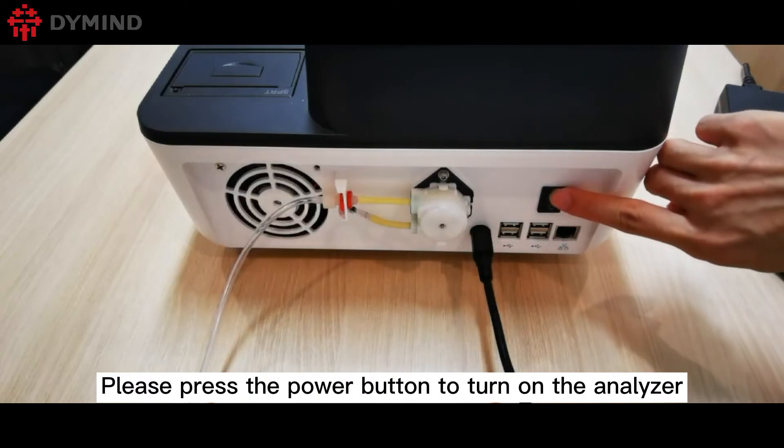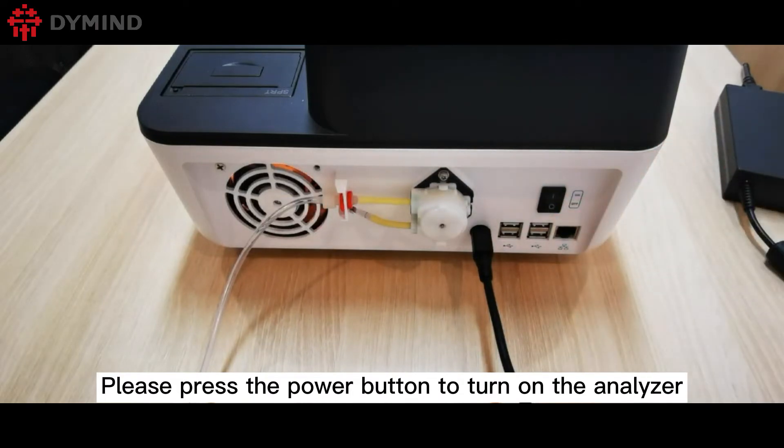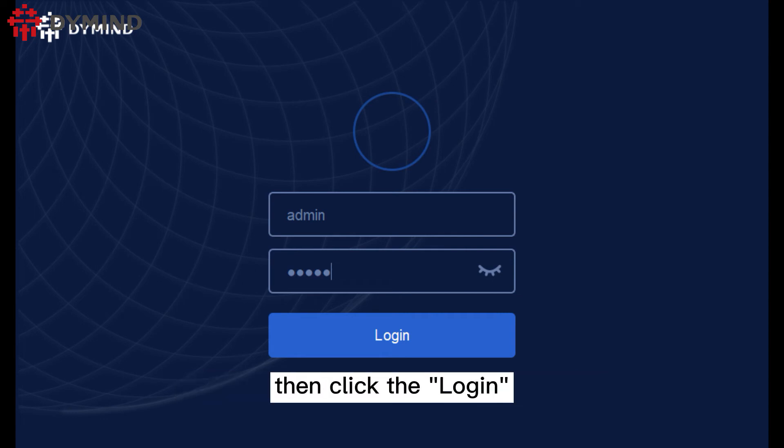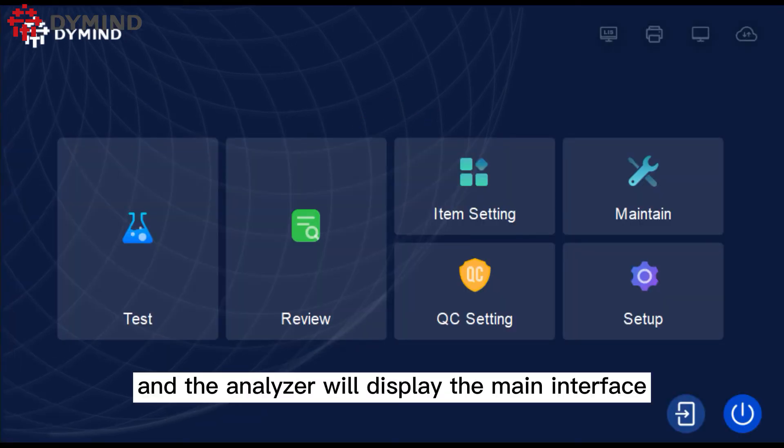Please press the power button to turn on the analyzer. Please log in to the analyzer as admin, then click login and the analyzer will display the main interface.